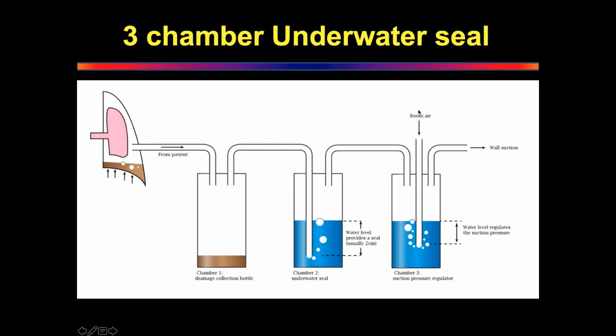This is open to the air. So all the suction is transmitted, and fluid is coming here. So this becomes like a 2 bottle, but with a room air for venting. Gentle pressure, for venting your pressure. So you cannot go really high and suck the whole thing. Did you understand this or no? It's very important to understand these concepts. Yes or no? Yes, sir.